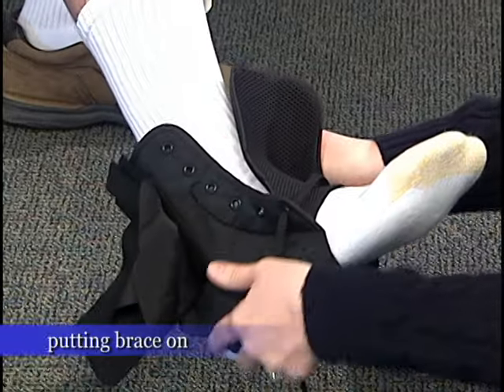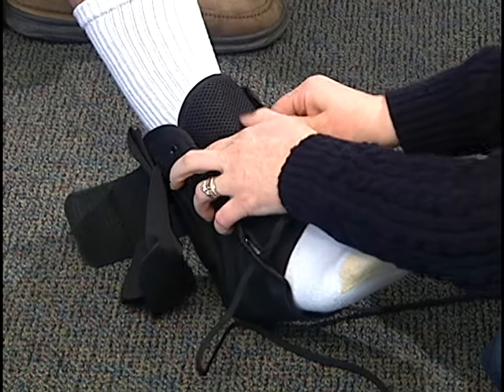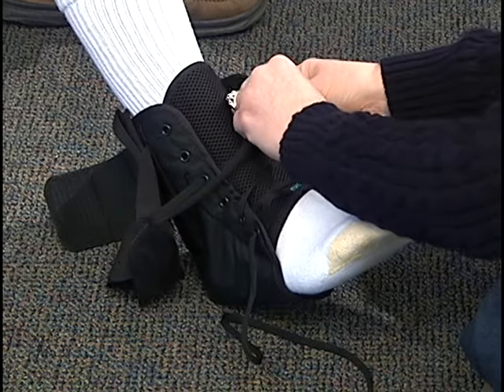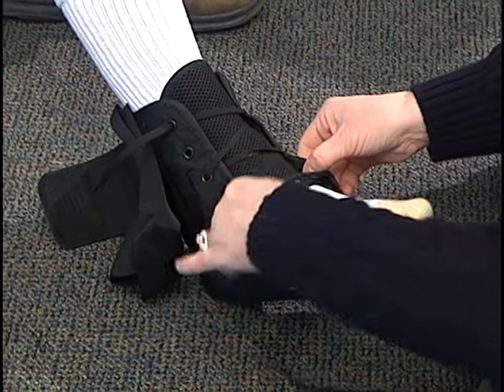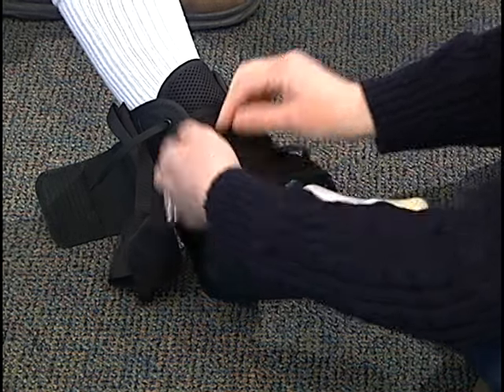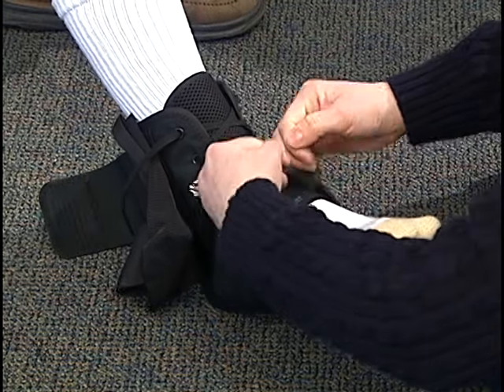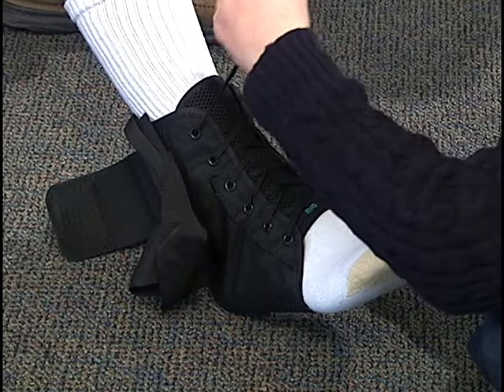Slide it all in so that the heel is in the hole. Make sure there's no creases in your tongue. Lace it up like a high-top shoe. Tighten it up — you want it to be snug, not cutting off your circulation. And tie it.